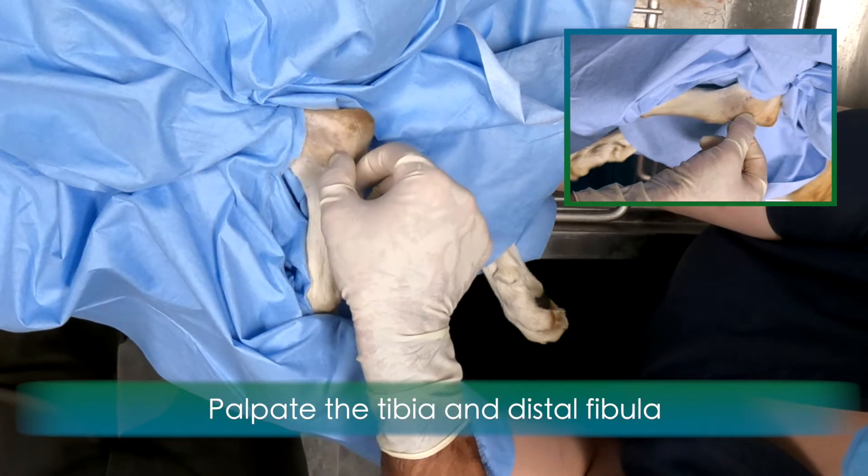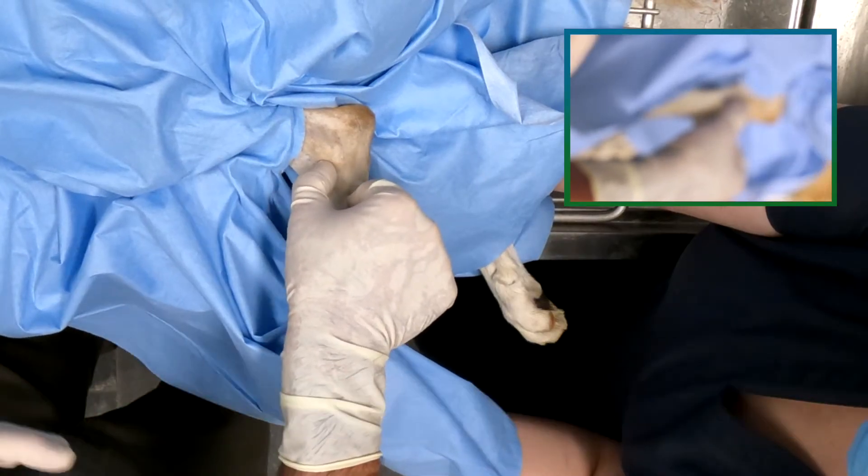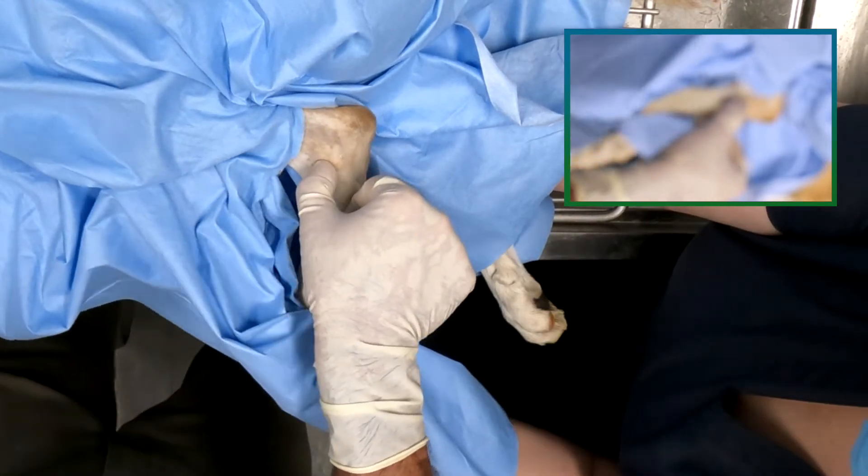Palpate the distal tibia and fibula as they intersect with the talus. Flex and extend the tarsus to identify the joint space.